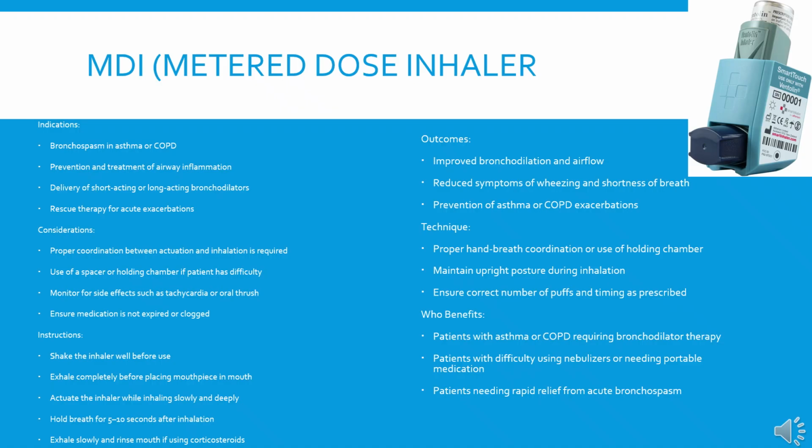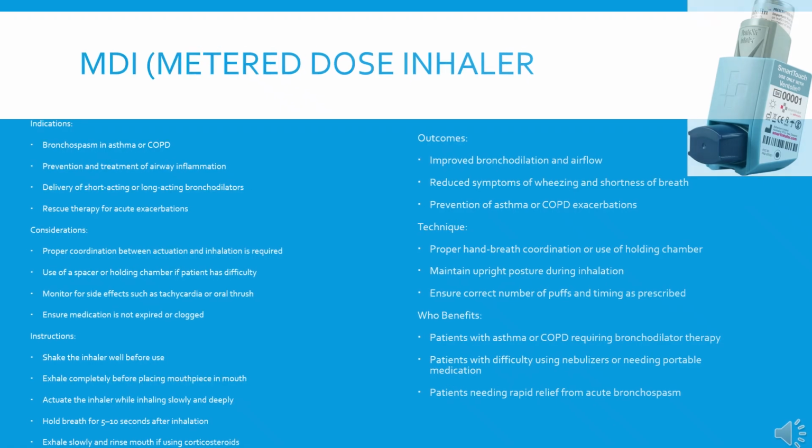Technique: proper hand-breath coordination or use of holding chamber. Maintain upright posture during inhalation. Ensure correct number of puffs and timing as prescribed. COPD and asthma patients benefit greatly.